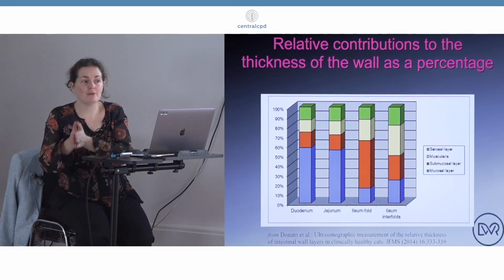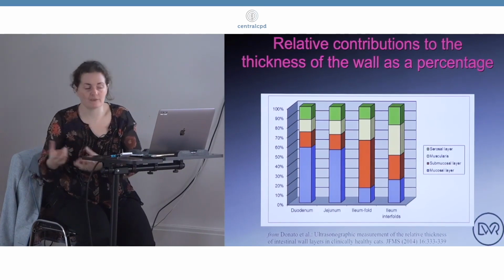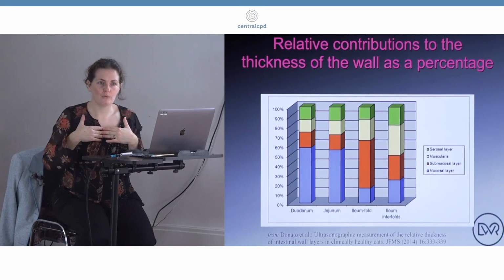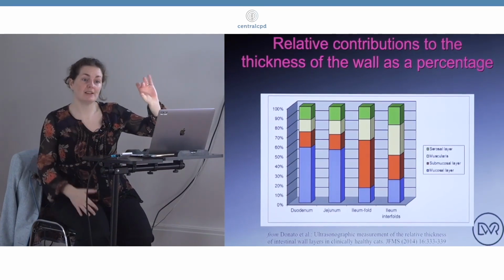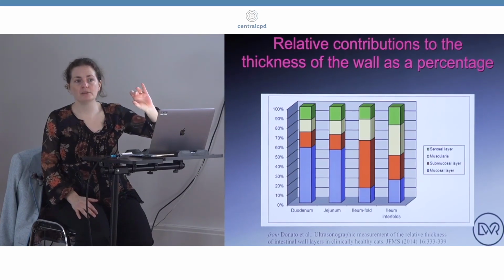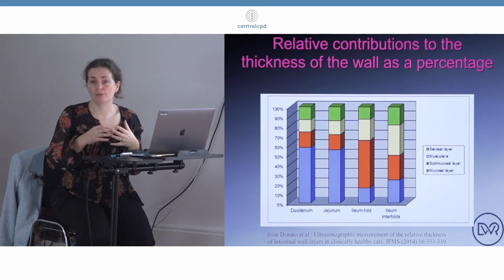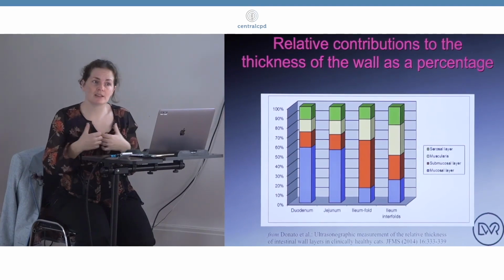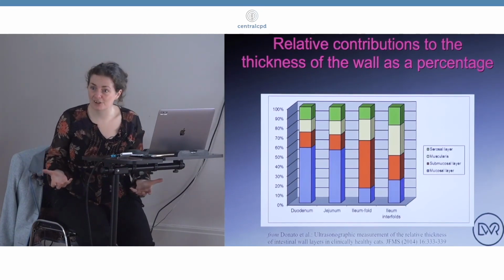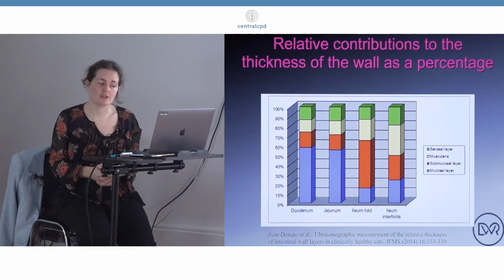So we have to use either biopsy or FNA, depending on how we're approaching it. In my feeling, with FNA of the bowel wall, when it's a normal overall thickness of 2 millimeters, I can get the needle in there, but I don't get a nice sample. So actually, if we see lymphadenopathy, that is where I would sample to see if we can make a diagnosis. And even then, sometimes the cytologists come back and say, I just don't know. And unfortunately, biopsy is often the only way to get a definitive answer in these cats.